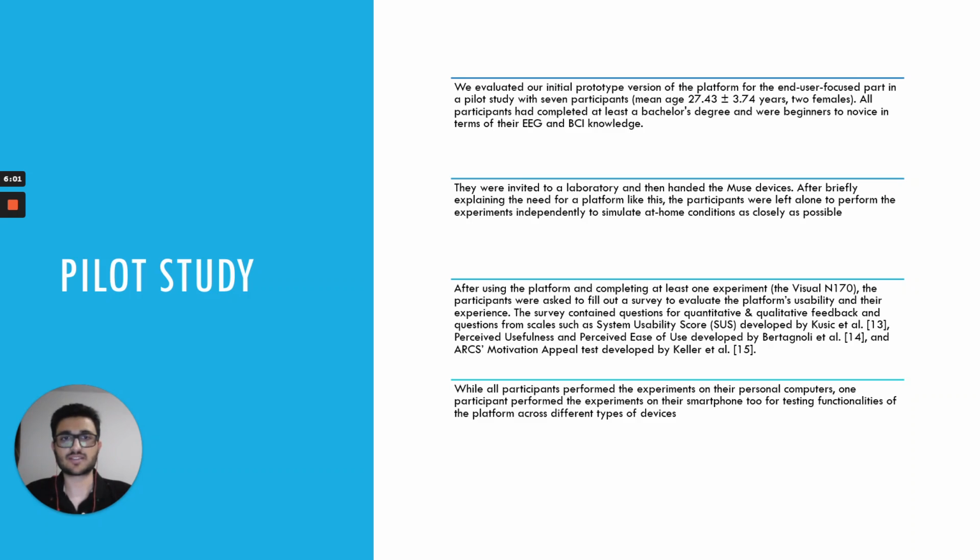We conducted a pilot study with 7 participants to evaluate our platform, and all participants had at least a bachelor's degree and were beginners to novice in terms of their EEG and BCI knowledge. They were invited to a laboratory and handed the Muse devices, and after briefly explaining the platform to them, they were left alone to do the experiments independently to simulate at-home conditions as closely as possible.